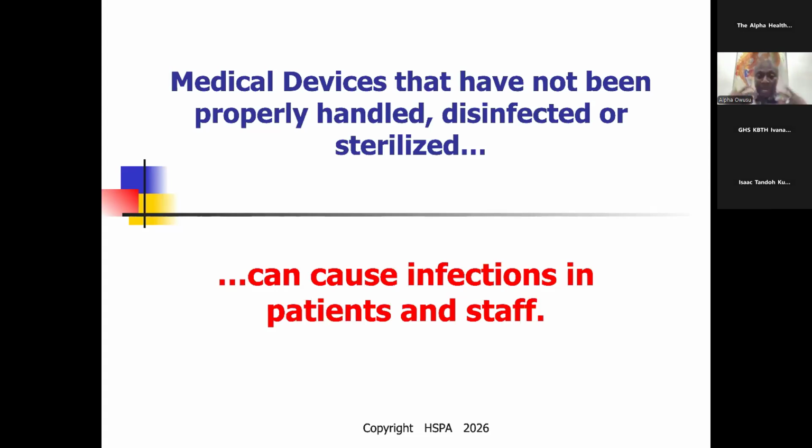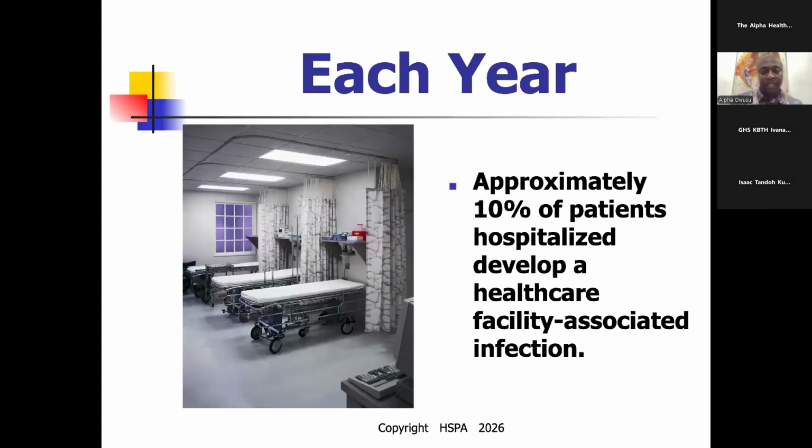From there, they wear that same cloth, right? They have eyelashes, they have nails, right? And then the microorganisms can hide under these nails. They can hide under your eyelashes. There have been events related where these things transport, right? Cross-contaminate from the workplace to your homes. And then you get your family infected. Very, very important. So we have to be very careful the way we look at how we handle soiled instruments, and we disinfect them and sterilize them.